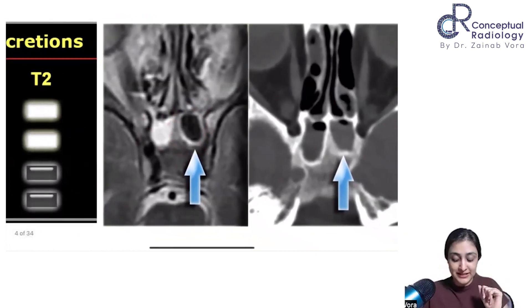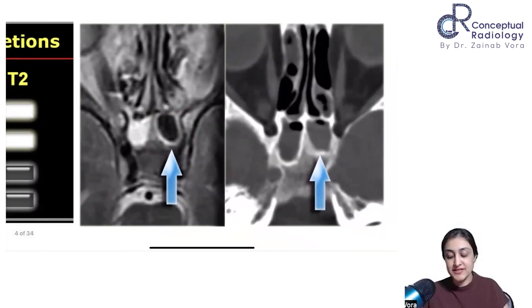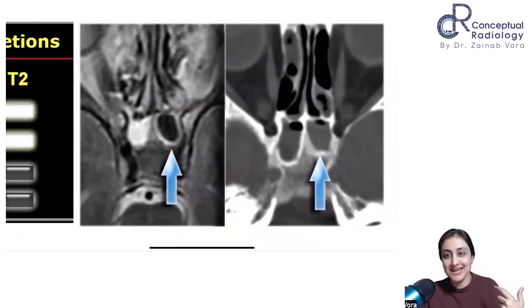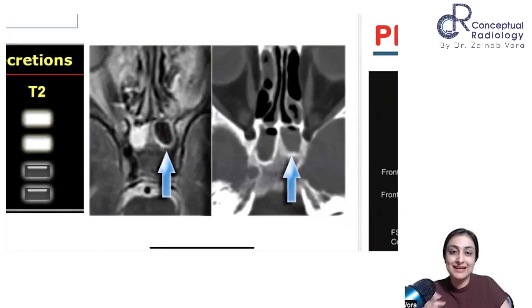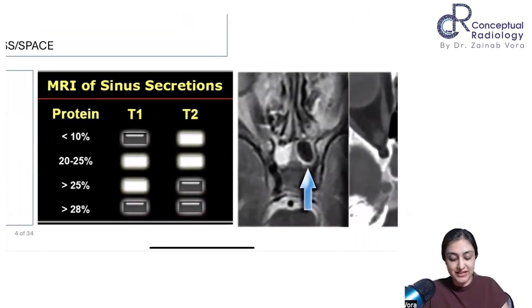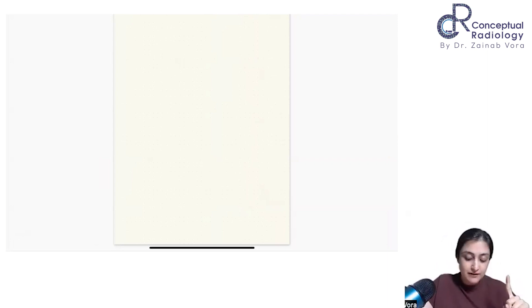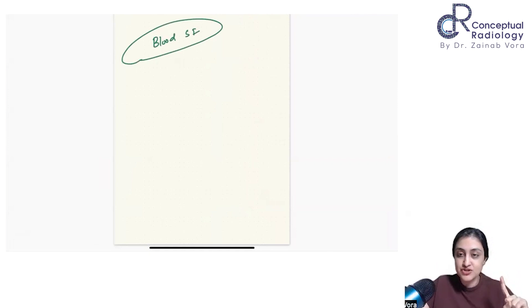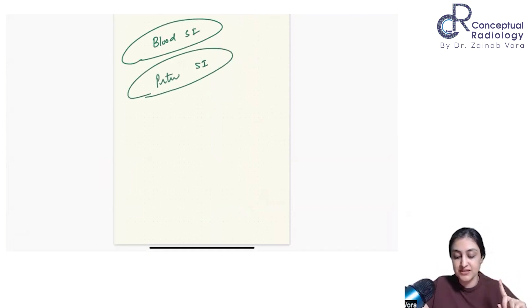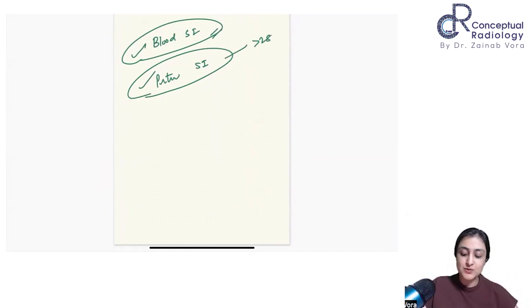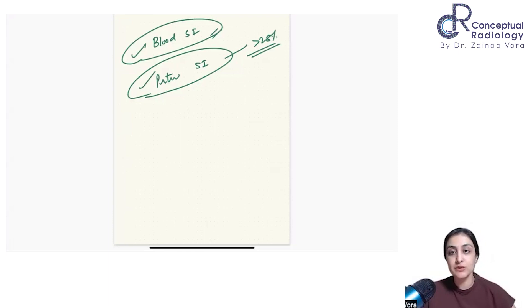When secretions appear T1 hyperintense in one sinus and hypointense on both T1 and T2 in another, CT correlation is essential — that's why a CT is always done for patients who have undergone a paranasal sinus MRI. When a sinus appears pseudo-normal on MRI, it indicates very highly protein-rich secretions. There are very few facts to memorize in radiology — one is blood signal intensity at different stages, and the second is protein signal intensity at different concentrations. Remember the mnemonic: 'I bleed, I die' for blood products, and a similar approach for protein content above 28% appearing pseudo-normal on MRI.